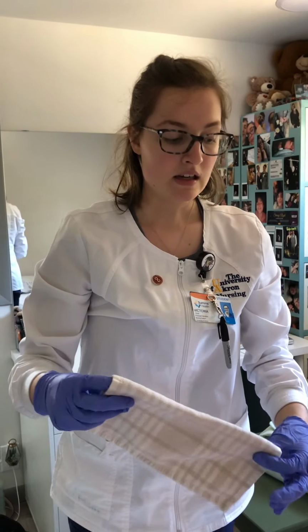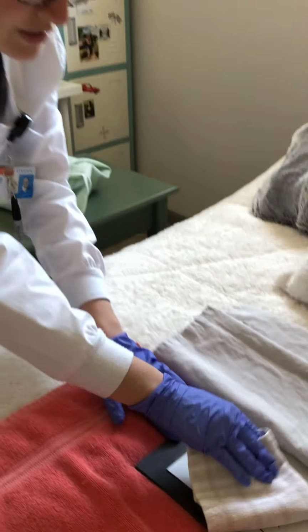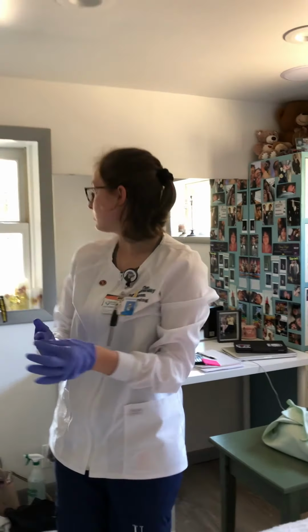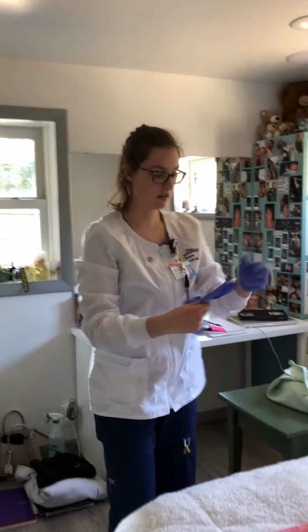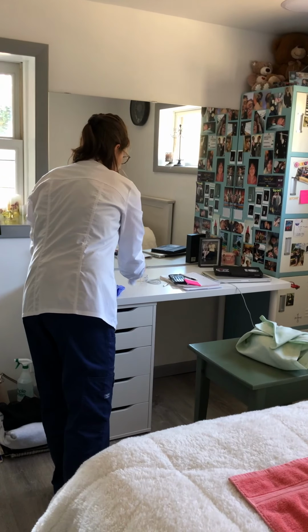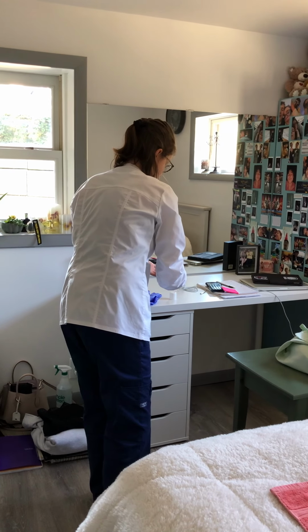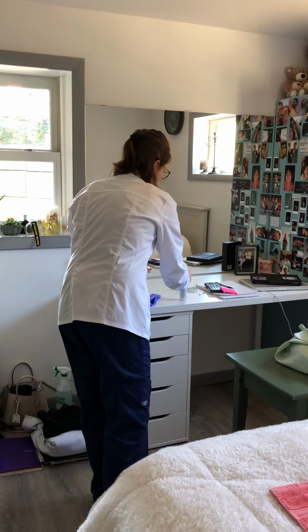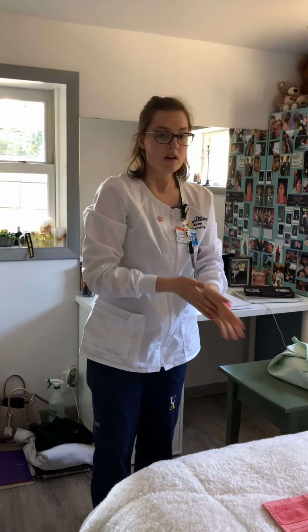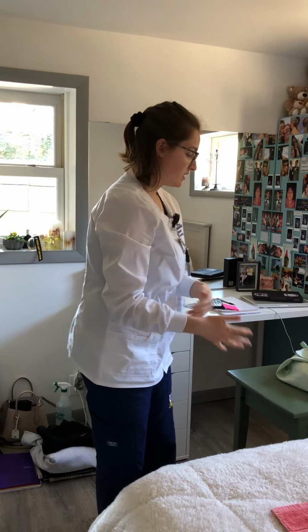And then I would go ahead and dispose of this cloth into the linen basket. Go ahead and have another clean, dry towel and just pat that area dry. Okay, and then dispose of that as well. All right, and then I would just go ahead and remove my clean gloves and perform hand hygiene again. At this point, you could always ask the patient, make sure that they're okay, that they're comfortable, that they're not in any pain, all right?